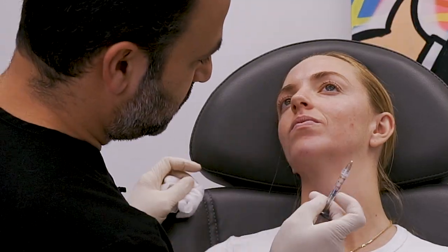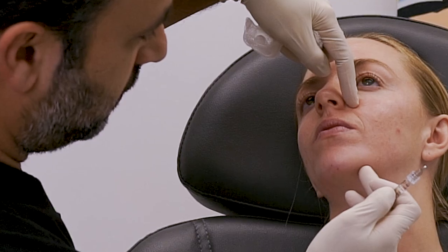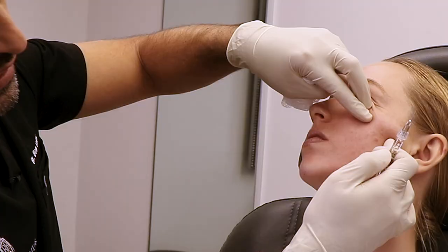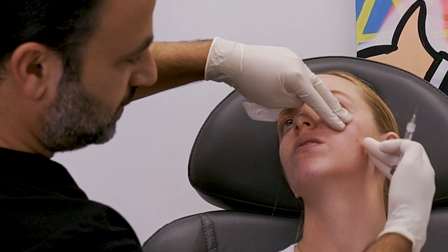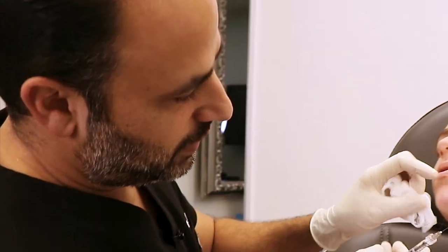Now we're going to go to the pre-jowl sulcus. You can see the jowls — if you follow the nasolabial fold down, it hits the jowl here. The pre-jowl sulcus is this area here; it goes into the neck — that's your submandibular gland. All of this droops as you age. If you do a facelift, it takes you back up and the jowl is gone. The jowl is not fat that you liposuction or Kybella — it's ptosis, a little bit of drooping that came down onto the face. We're not operating on it; we're going to camouflage it.